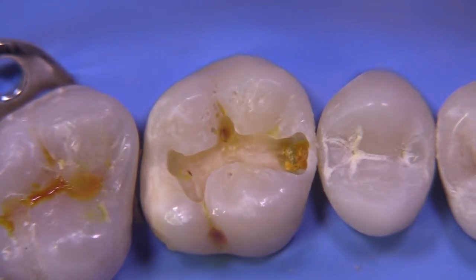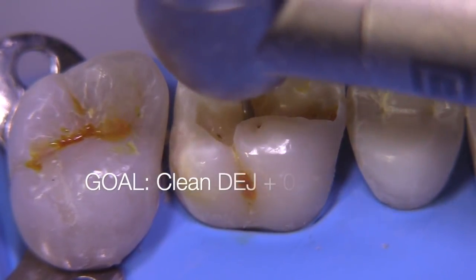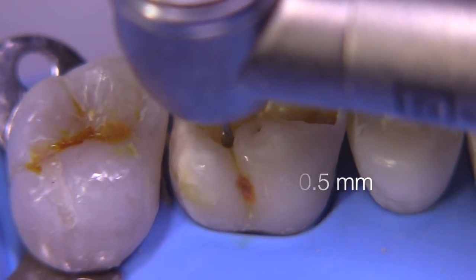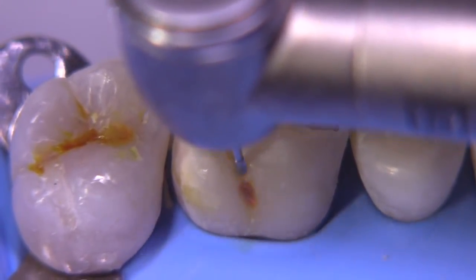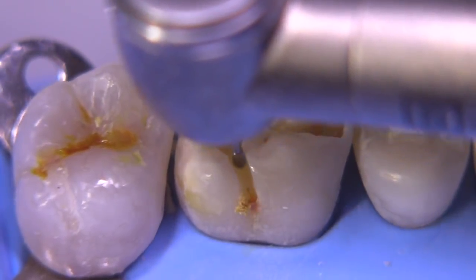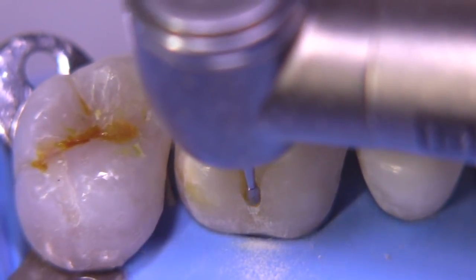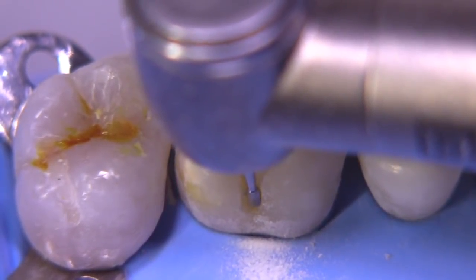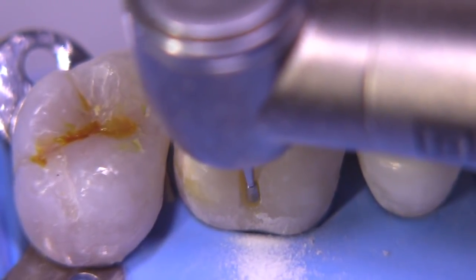The goal of our outline form is to get a clean DEJ plus an additional 0.5 millimeters beyond the DEJ when possible or even more. We're going to move the burr in the fissure and drop down into the caries area with the idea that we want to go into dentin slightly and make sure that the walls on the mesial, distal, and gingival are caries free.